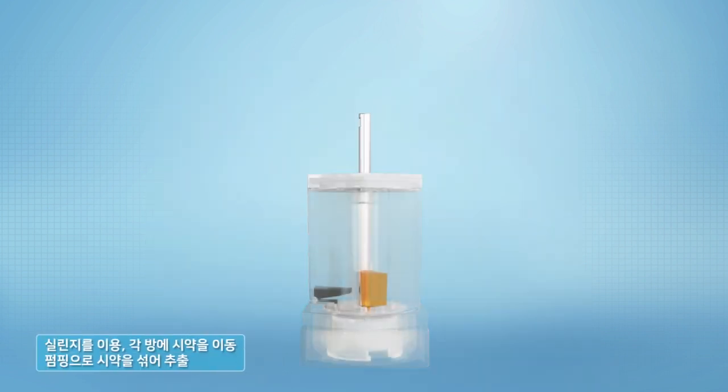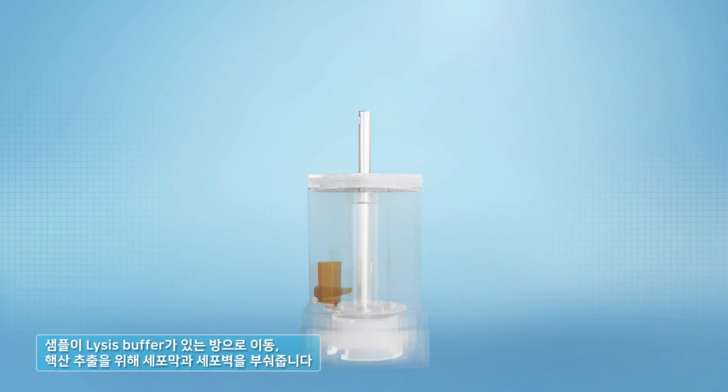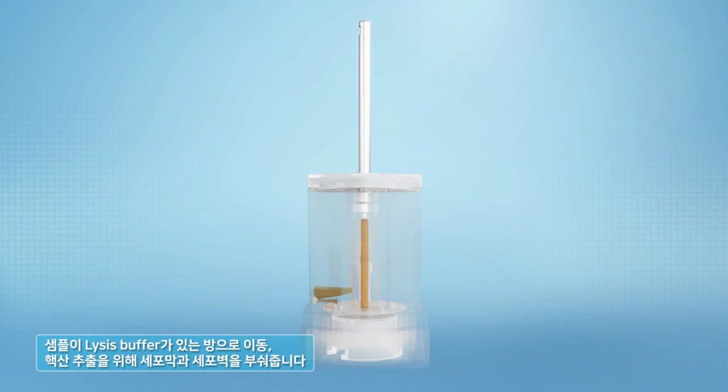When the protocol starts, the reagent is moved to each chamber by a syringe in the cartridge and is mixed by pumping during the extraction process. The sample is moved to the chamber with lysis buffer and pumped to break the cell membrane and cell wall for nucleic acid extraction.